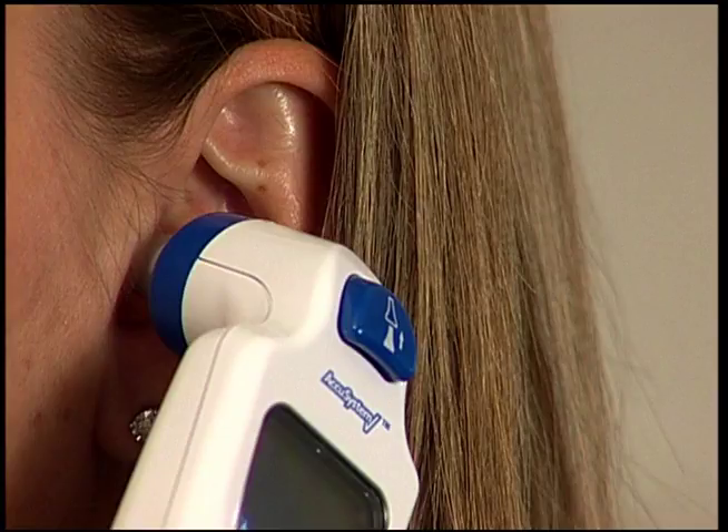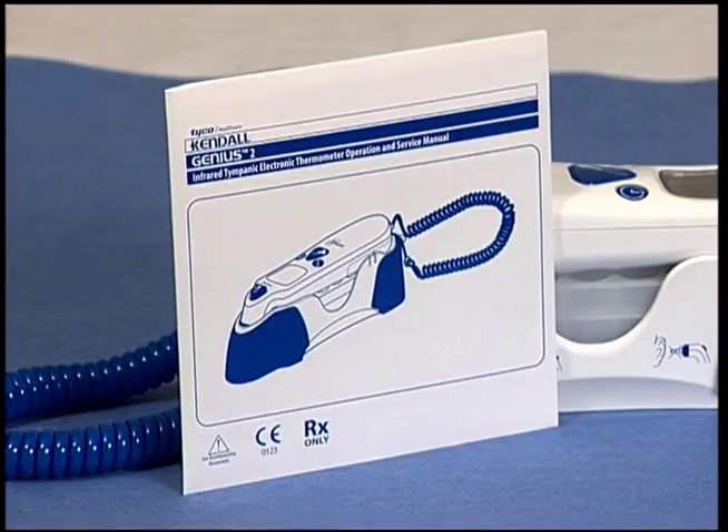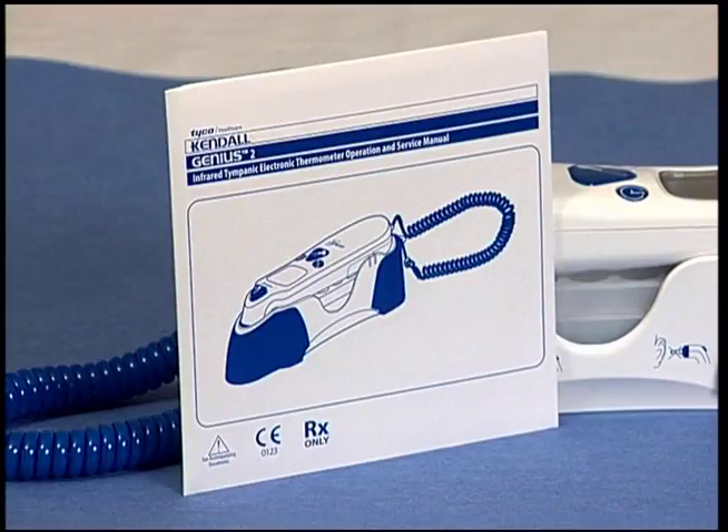Also, make sure the Genius 2 is used within the acceptable room temperature limits of 60 to 91 degrees Fahrenheit. Minor changes in room temperature will not significantly affect the reading. However, use of this device outside of the operation limits may affect the accuracy of the reading. The Genius 2 should also be stored away from extreme temperatures. Please see the operation manual for storage guidelines.